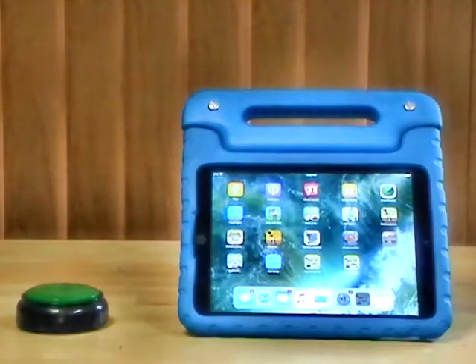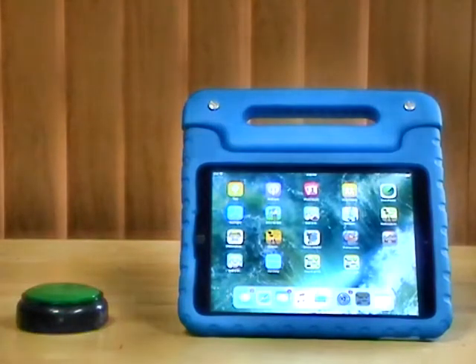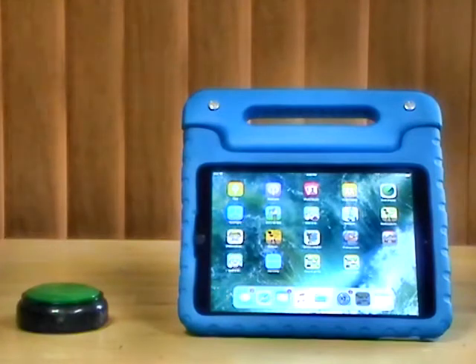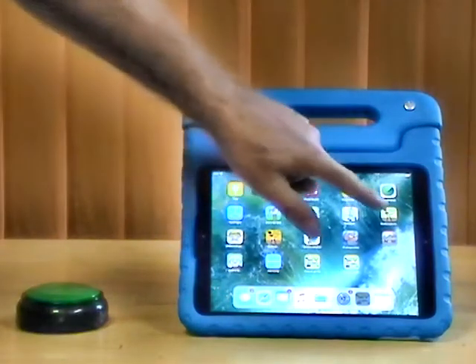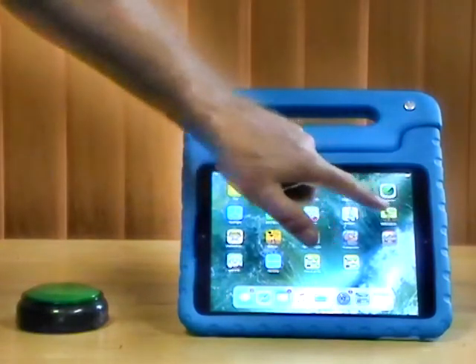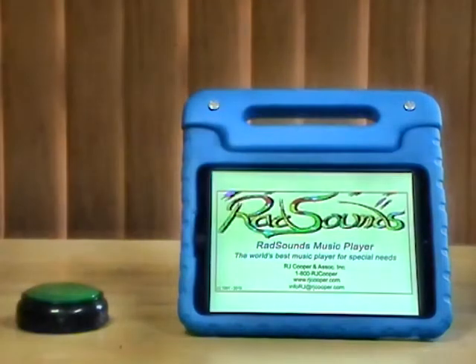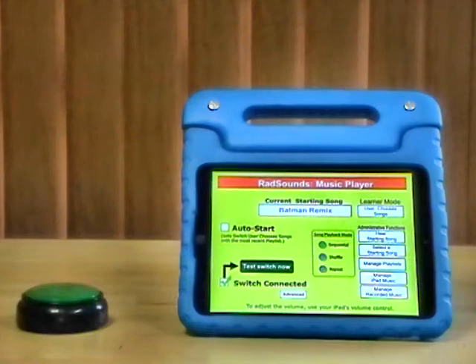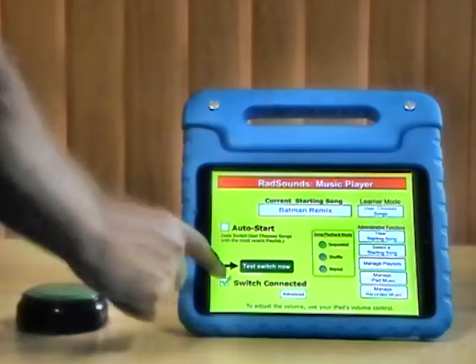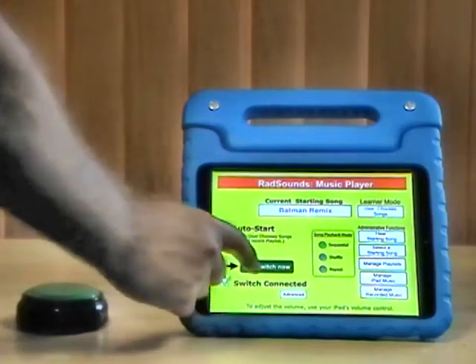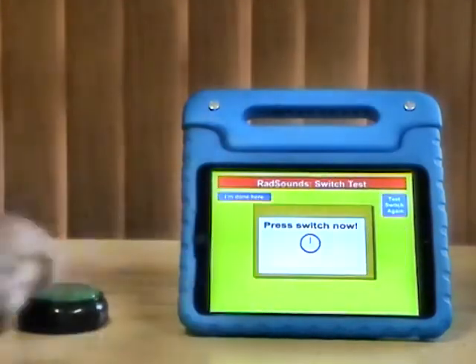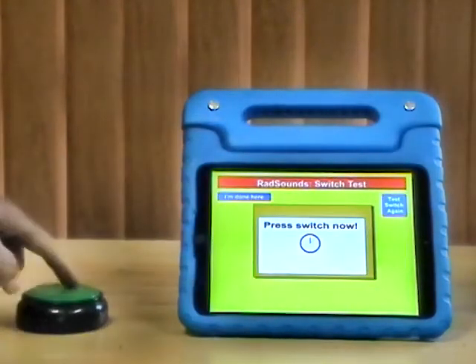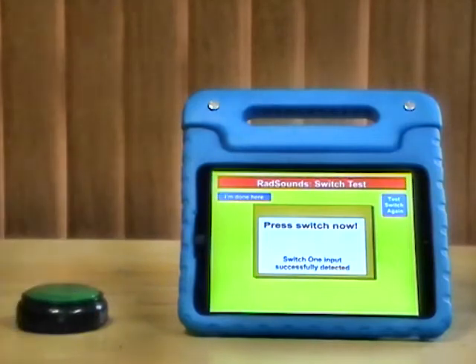I'm going to launch my Rad Sounds music player and we have switch connected. We'll test switch now and it works.